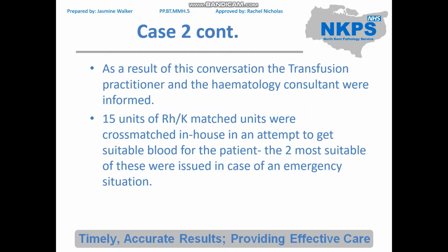So when we set up this selection of units, obviously we did RH matched, and we ended up choosing the two most suitable, so the ones with the weakest reactions, to be issued to the patient. We kept these to one side though, so if they did come and get it, we could make sure they were aware of the implications of having the units.